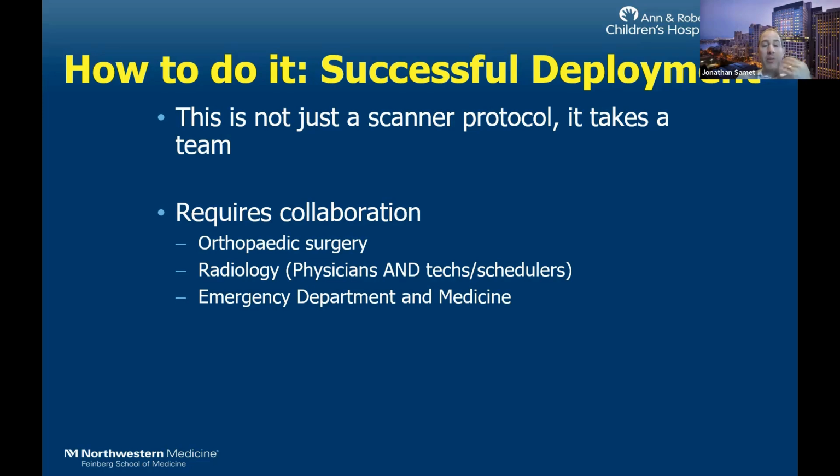We need to collaborate with the emergency department, tell them when to do this. They can't be doing this test to rule out meniscal tear, right? They can't just do rapid study. That's what I saw from my neuro colleagues, issues they had when they just called it rapid brain. They would do it for inappropriate indications. You want to only do it for true MSK infection. And that's why, when we created the order in the hospital system, it's literally called acute MSK infection. So the only way that they can do it is if they're thinking infection.